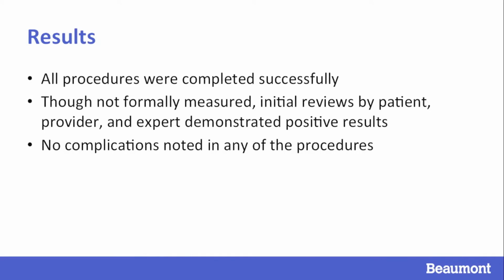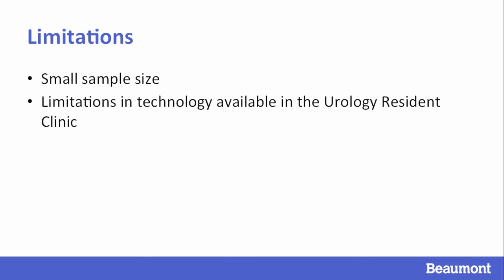All procedures were completed remotely with no adverse events. Though not formally measured during this proof of concept study, initial reviews by patients, providers, and experts all indicated positive results in terms of satisfaction and comfort with the new technology. Limitations of our proof of concept project include small sample size.